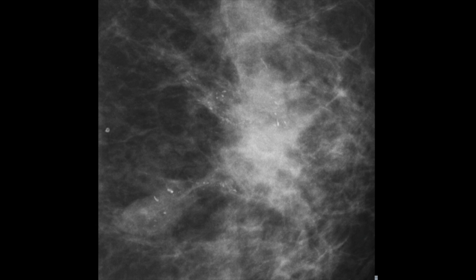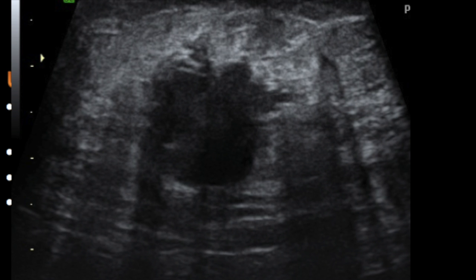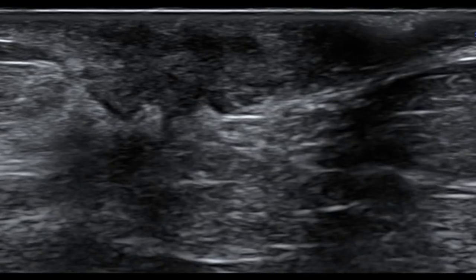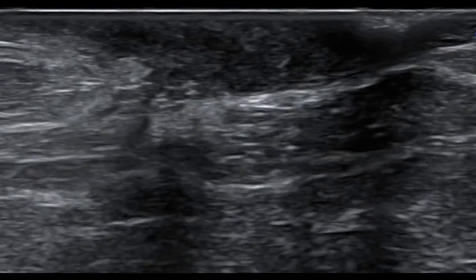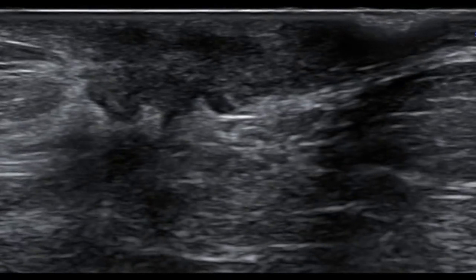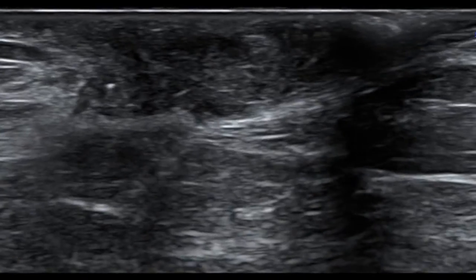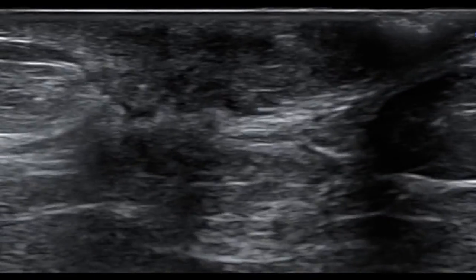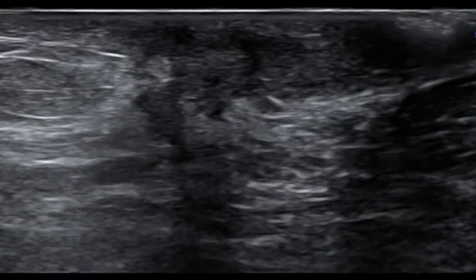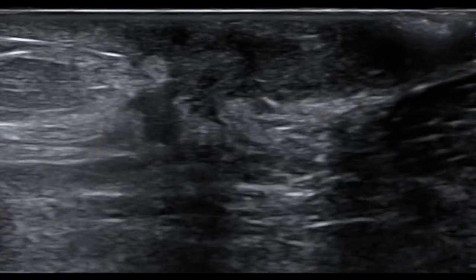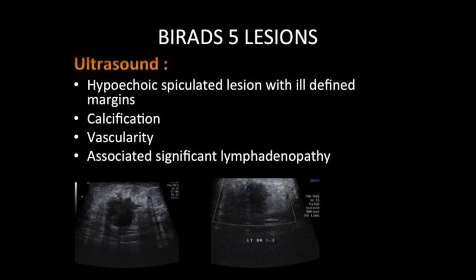On ultrasound, they appear usually as hypoechoic mass lesions with irregular ill-defined margins. Calcification may or may not be seen. Vascularity may be seen in most cases. Associated significant lymphadenopathy may also be seen.